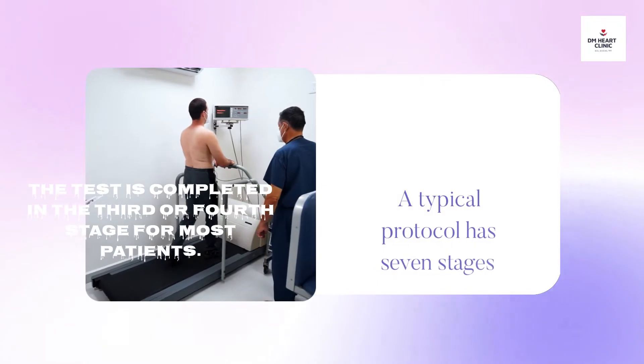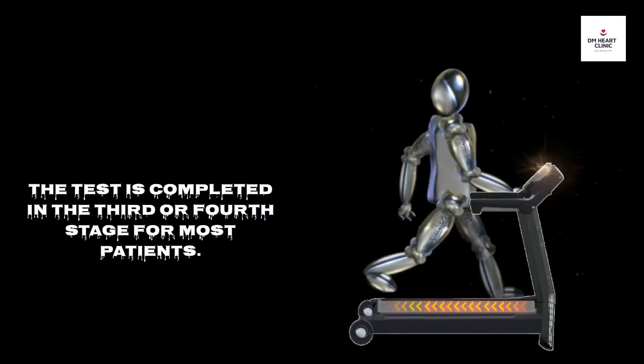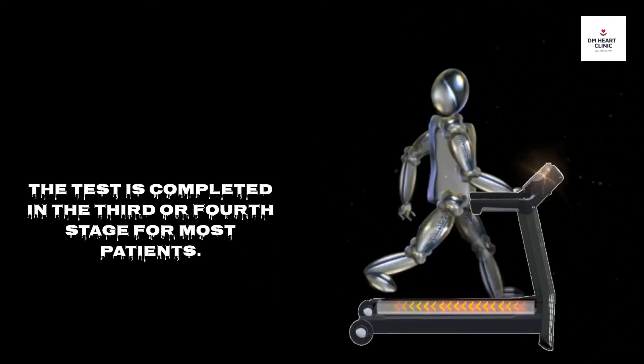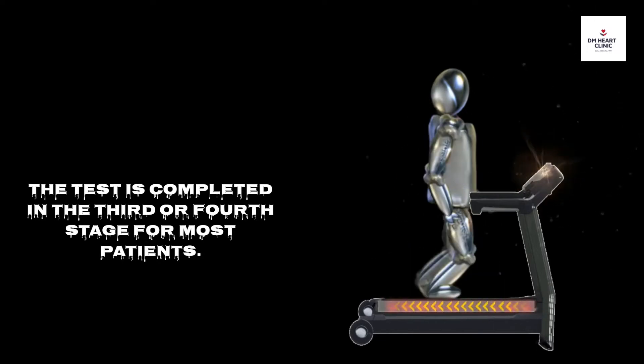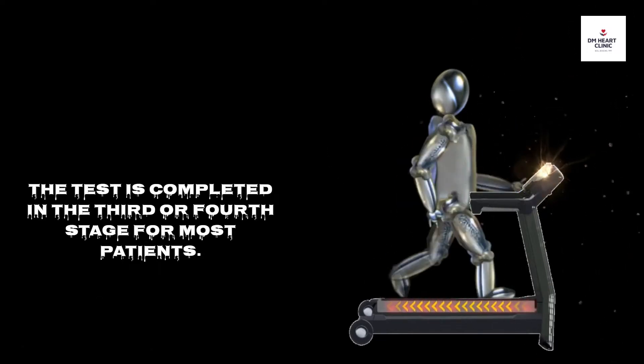A typical protocol has 7 stages with 3 minutes each. The test is completed in the 3rd or 4th stage for most patients. Rarely, you may need to run until the 6th or 7th stage. Sometimes the test gets completed in the 1st or 2nd stage only.